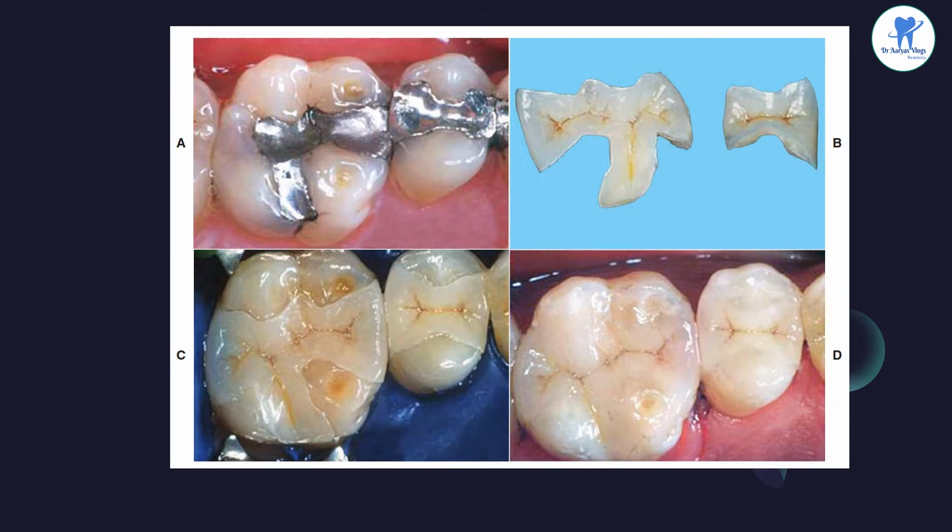In this picture, it shows ceramic inlays, which are an aesthetic replacement for more readily visible amalgam restorations. So these are the visible amalgam restorations and these are the defective amalgam restorations. And here these are replaced by using all ceramic inlays. Here there are 2 all ceramic inlays and this picture shows the teeth restored with ceramic inlays, with a better aesthetic appearance compared to this.